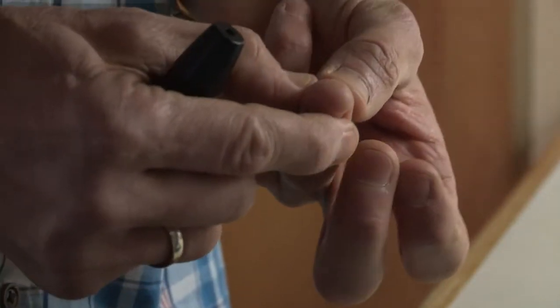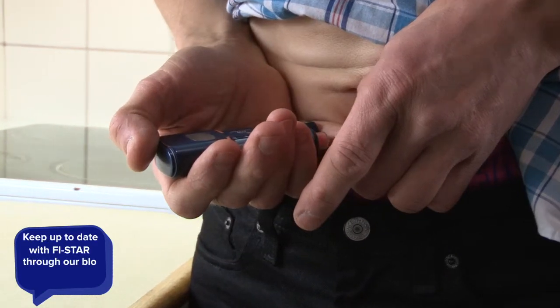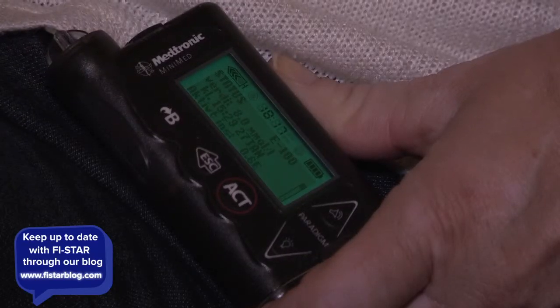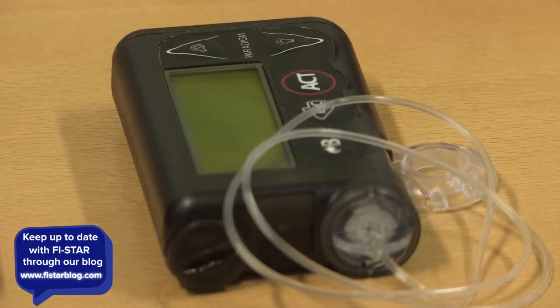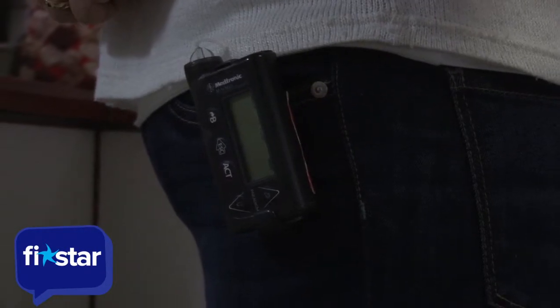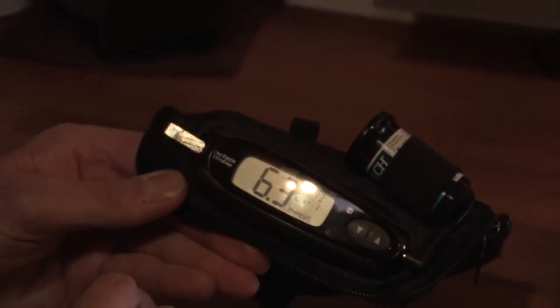requires insulin to manage their diabetes, this usually means multiple daily injections by either syringes or a medical pen. The use of an insulin pump, a medical device used for the administration of insulin, allows intensive therapy to take place and should be used in conjunction with blood glucose monitoring and carb counting.